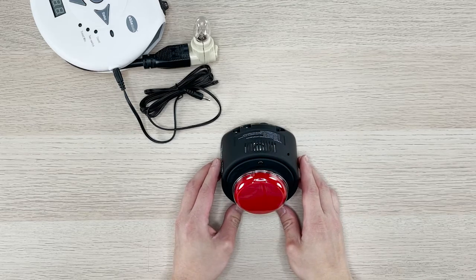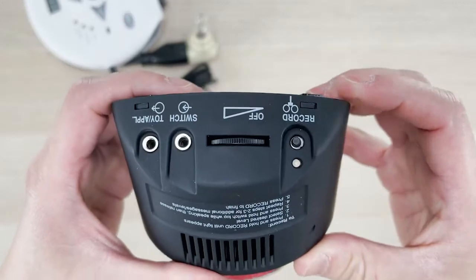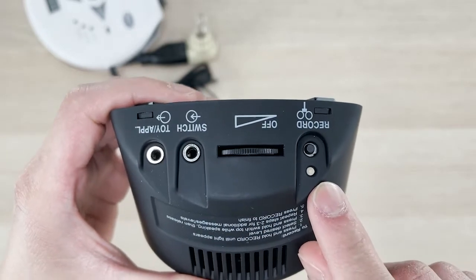Now, let's power on our device. On the back of the device, there is a dial. Turn to the left and you will hear a click, as well as the LED to the right will light up red once.